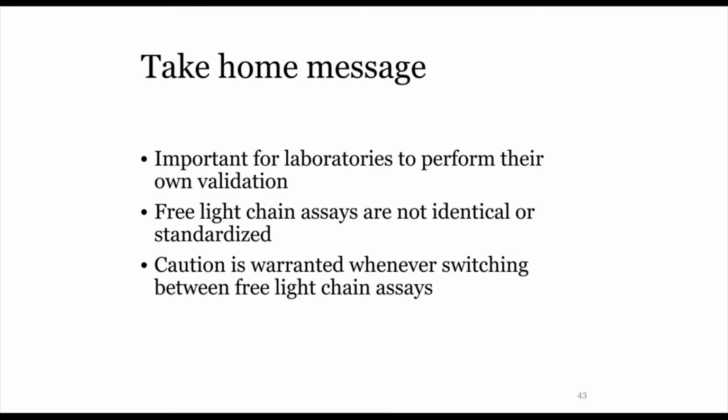And how did your findings compare to results from other Diazyme evaluations that have been published? So as far as I'm aware, there may potentially be more by now. When I last did the literature search, there were 2 studies that have been published. One by Alan Wu at UCSF, and another, I believe, from Louisville. And they have both sort of shown that the assays are relatively comparable.